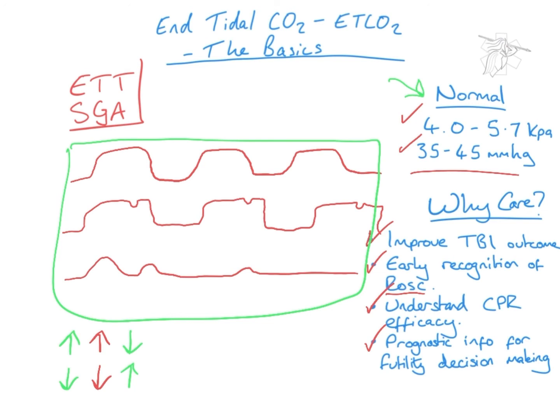So this was for your hypercapnia, and this is for your hypocapnia. And actually you find with these patients, often it's a balancing act between bagging them too fast or too slow to maintain a normal range of end-tidal CO2 with them.